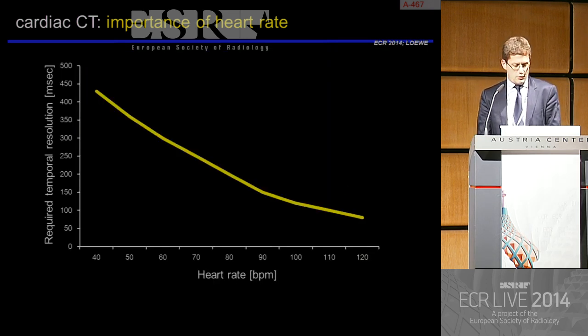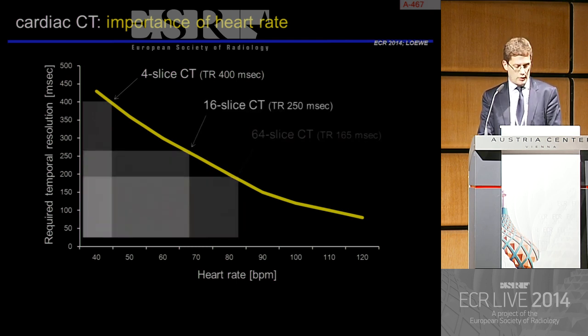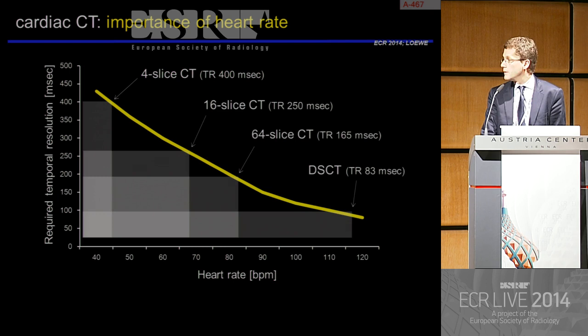The good news is that over the last couple of years, we could observe a really extraordinary improvement in the technical performance of modern scanners, even showing an excellent improvement of the temporal resolution, starting from the four-slice era at a temporal resolution of about 400 milliseconds. We are now dealing with temporal resolutions of below 100 milliseconds, 80 milliseconds, and even shorter.